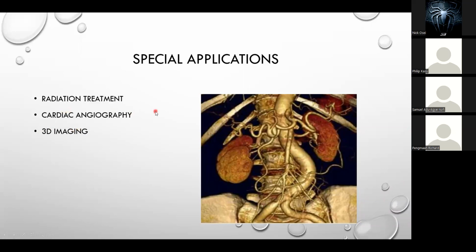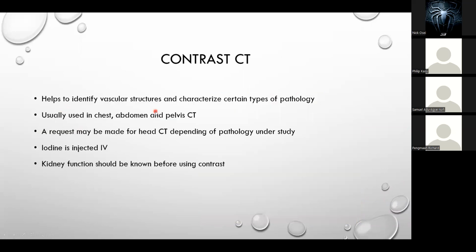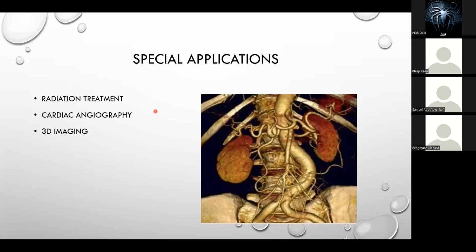Also, they can use it for cardiac angiography, where they will use it to do a 3D reconstruction of the various cardiac vessels. Then also, for those who are going in for radiotherapy, they use this to map out areas where they can implant the active material, for instance.